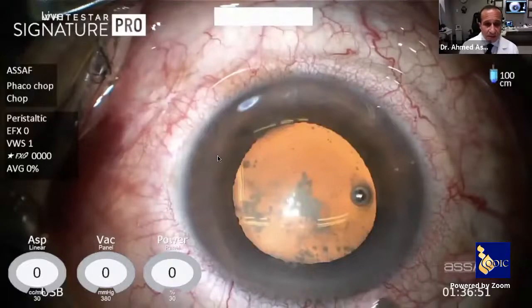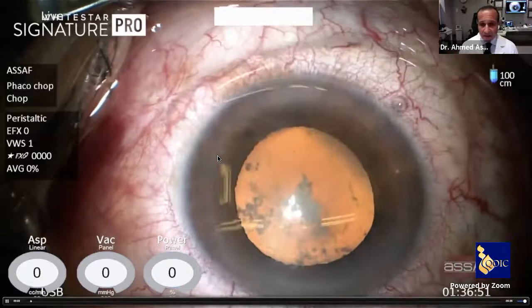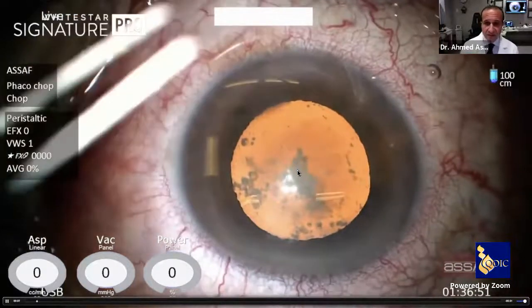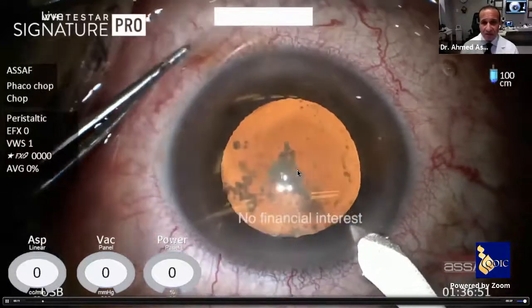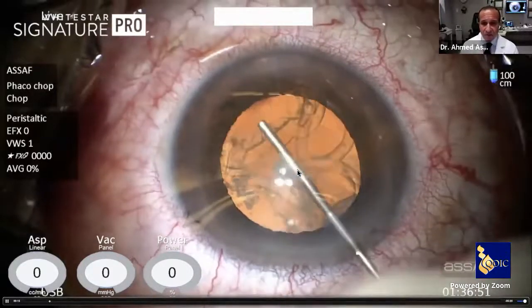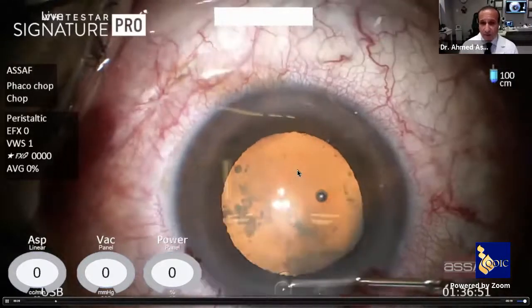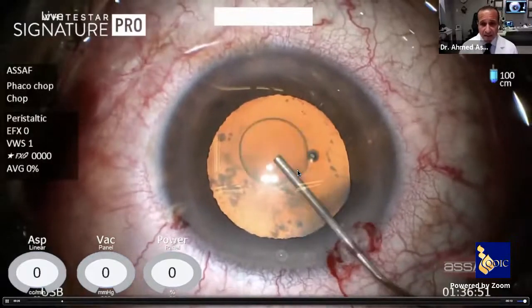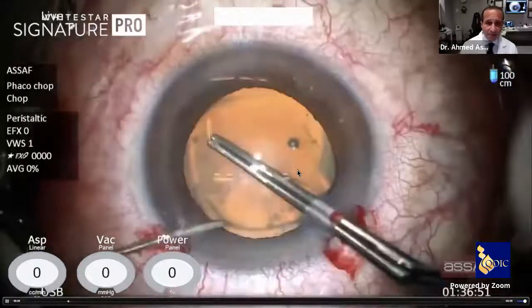This is the video that will summarize most of the points that I have been discussing right now. This is a case of a vitrectomized fluid-filled eye. You can see some remnants of emulsified silicone oil in the anterior chamber under the dome of the cornea. It's quite common to see some remnants of silicone oil inside the anterior chamber. It can be easily removed by injection of dispersive and cohesive OVD during the soft shell technique prior to rexis formation.